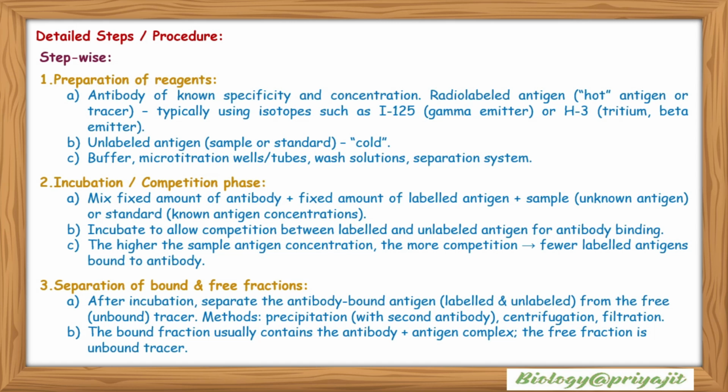Incubation or competition phase: a fixed amount of antibody with a fixed amount of labeled antigen and sample or unknown antigen, or standard known antigen concentration. Incubate to allow competition between labeled and unlabeled antigen for antibody binding. The higher the sample antigen concentration, the more competition, and fewer labeled antigens bound to antibody.